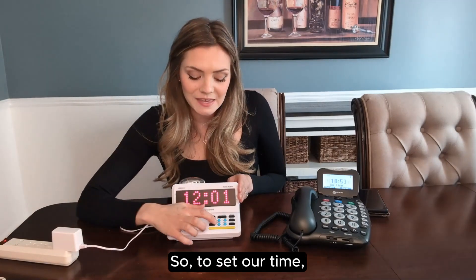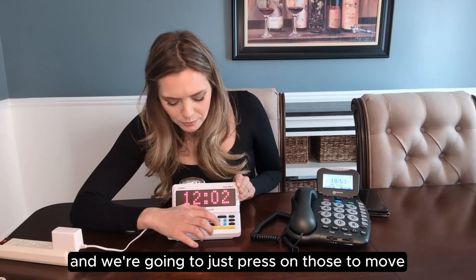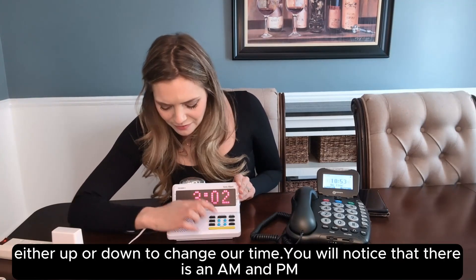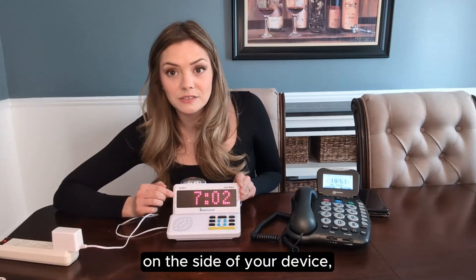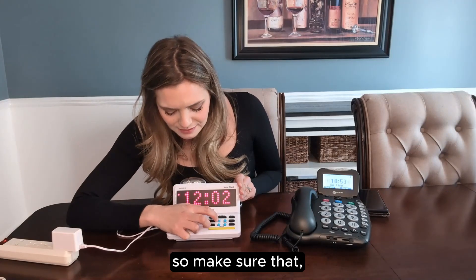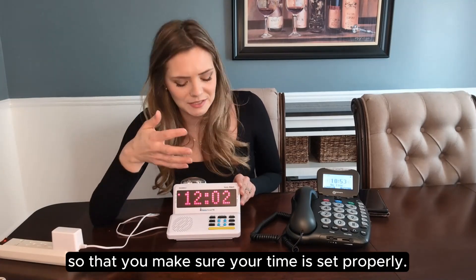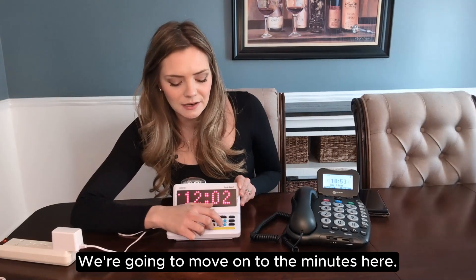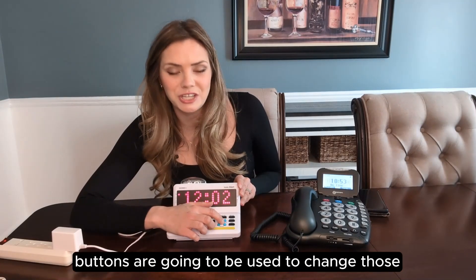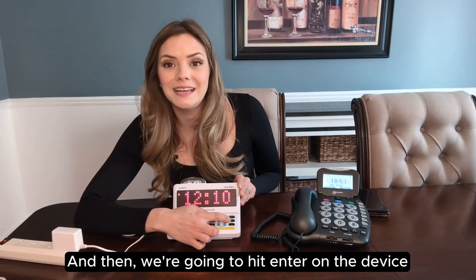To set our time, we're going to start with the hour using the volume and hour buttons — just press on those to move either up or down to change the time. You will notice there is an AM and PM dot that shows up on the side of your device, so make sure that if it's 12 PM you have that PM dot showing so your time is set properly. I'm going to set mine for 12:10. We're going to move on to the minutes — the tone and minute buttons are used to change those. Click up until you hit the number 10, then hit enter on the device to lock that time in place.